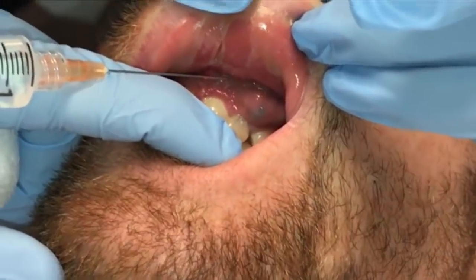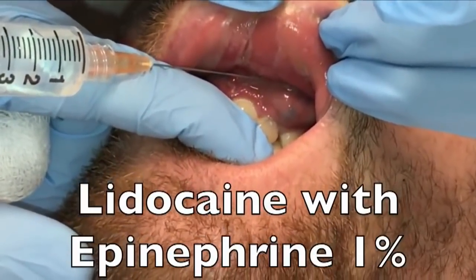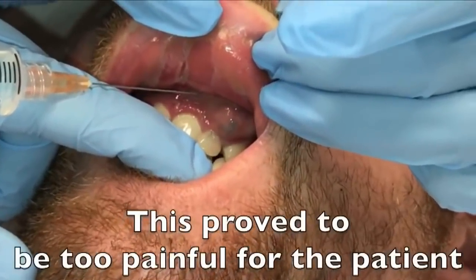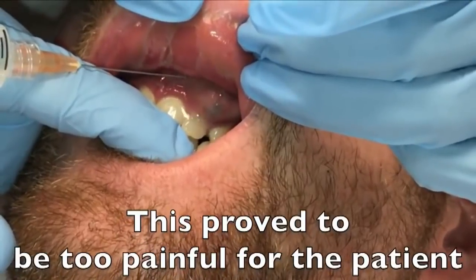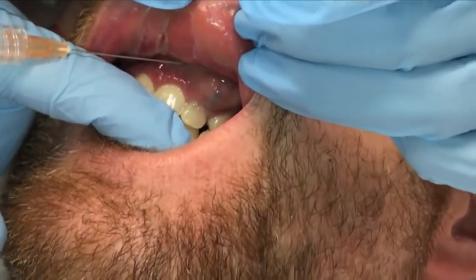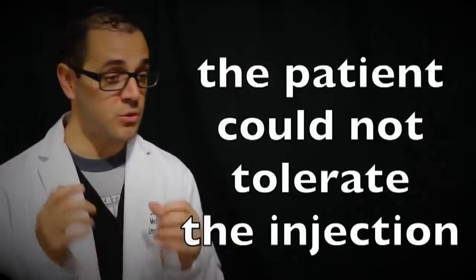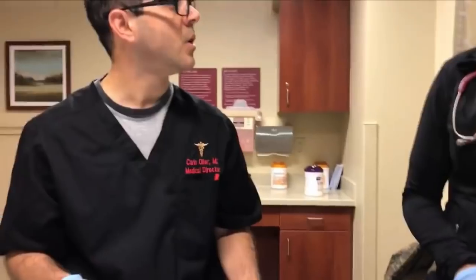Initially, we went to do a local injection of numbing medicine right at the border of the gum and the lip on the inside. He had a big fluctuant abscess on that corner there. There are some regional blocks you can attempt on the face, but this is so localized, we just tried to go underneath and inject some lido with epinephrine, hoping that the epinephrine would make the numbing last longer and give him better relief after he was done in the emergency environment. However, the local injection of the lido with epinephrine caused him way too much pain.